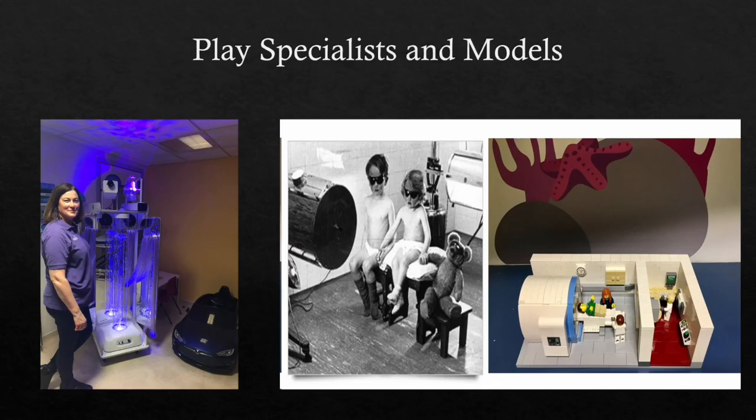And here's an example of Denise, our wonderful play specialist who works with us regularly in radiology. And we are also lucky enough to have a Lego model which the patient can play with and interact with beforehand, which is really special and really works wonders. And then just a little nostalgic picture in the middle, which we don't use anymore.